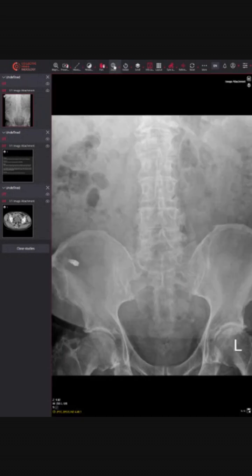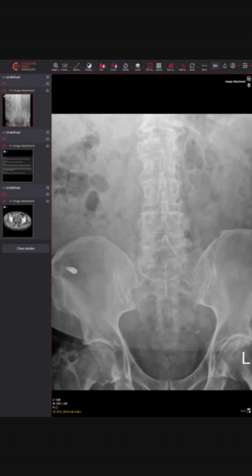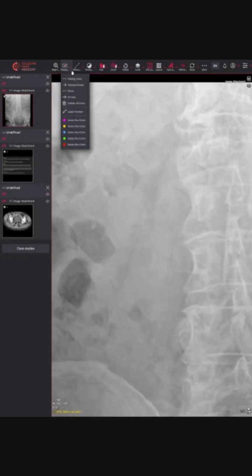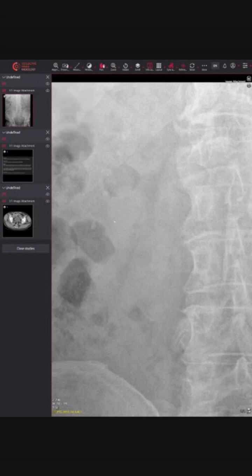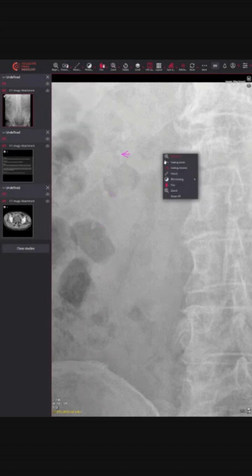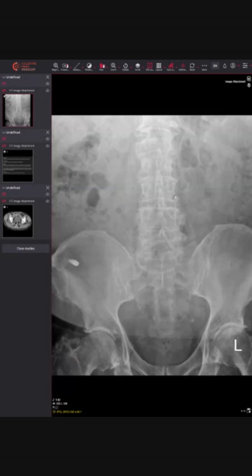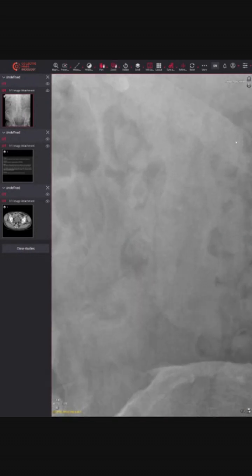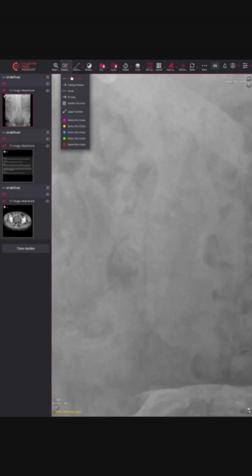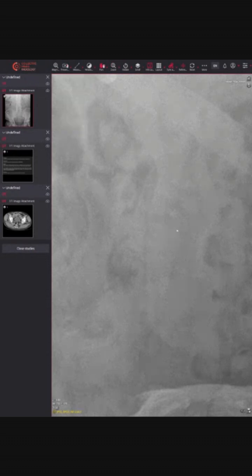If we also look up here, we can see we've got further smaller calculi in the upper, mid and lower pole of the right kidney. And also, if we zoom across on this side, we've got a tiny — although it's probably difficult to see — tiny little calculus within the mid pole of the left kidney.